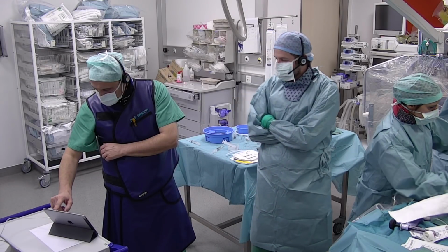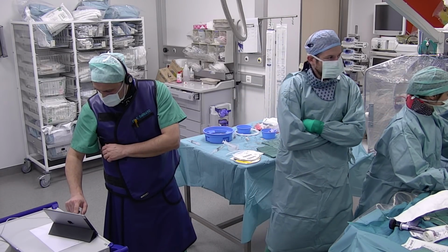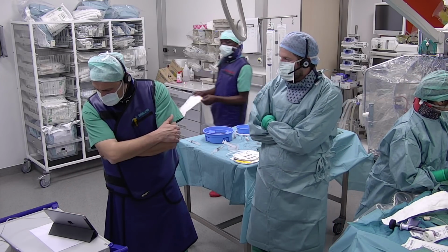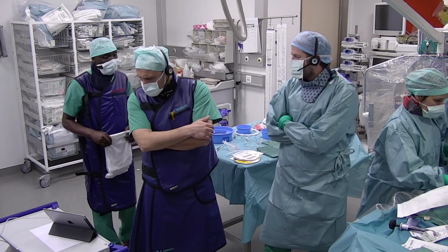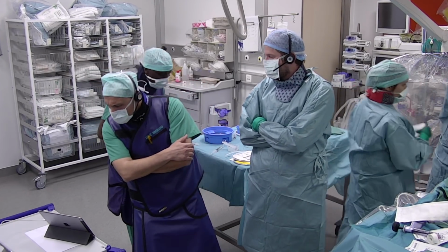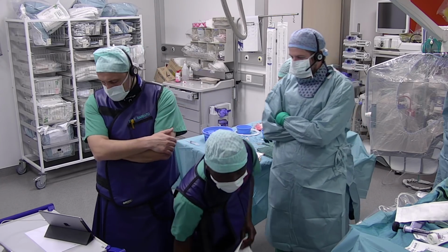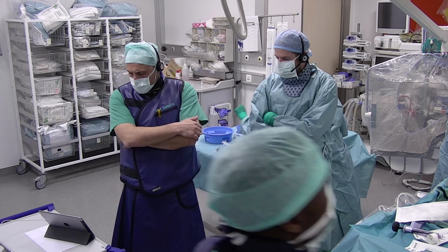The contrast volume you use is less. But I think to do PCI optimization, so assess the stent after placing it, it goes much better and easier with OCT. So in the end, use what you are familiar with. I think this could be the strongest suggestion from our side.